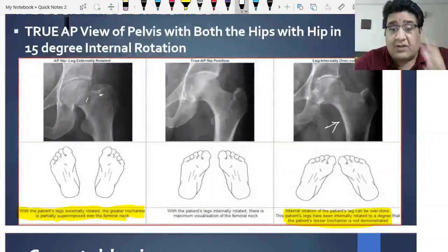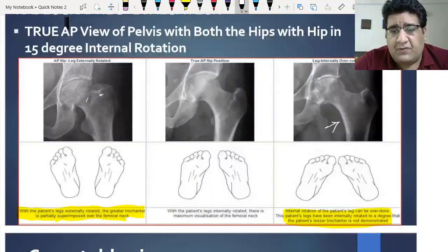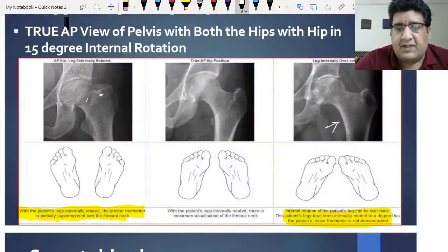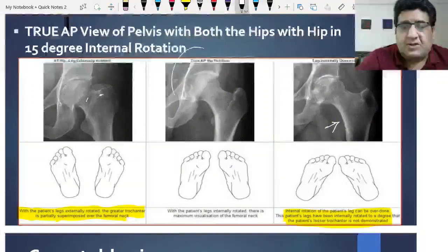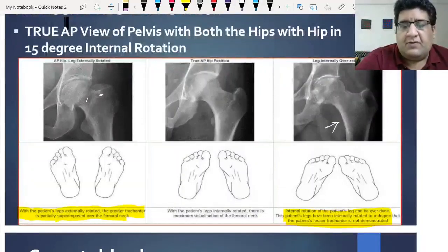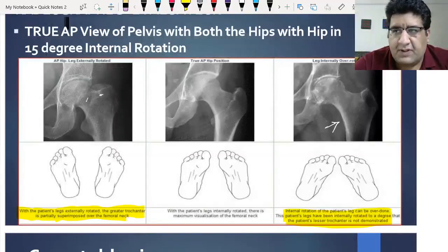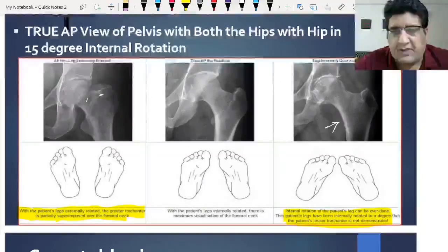So the most ideal thing is to have a true AP view with the legs in 15 degrees of internal rotation. This is the true AP position which gives you the ideal landmark. This is the first investigation: X-ray of the pelvis with both hip joints.